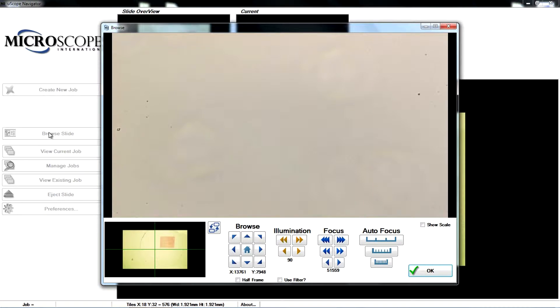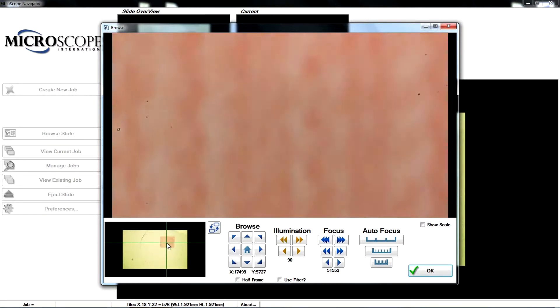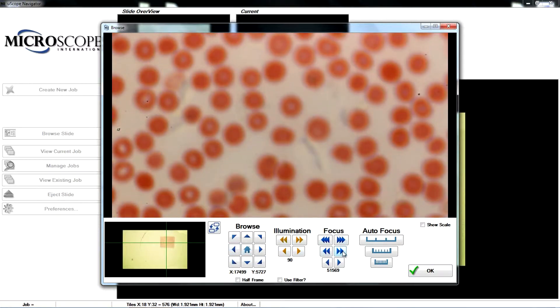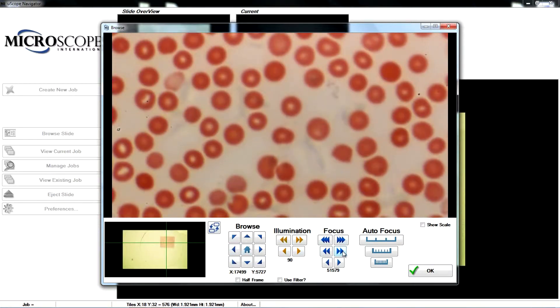Controls in the browse window provide for navigation, illumination, and focus. You may click in the Overview area to select the part of the slide to view. Use the manual focus or the automatic focus controls to bring the image into focus.